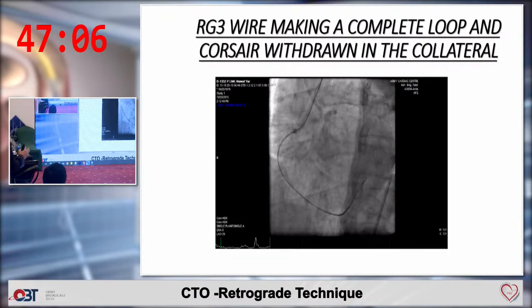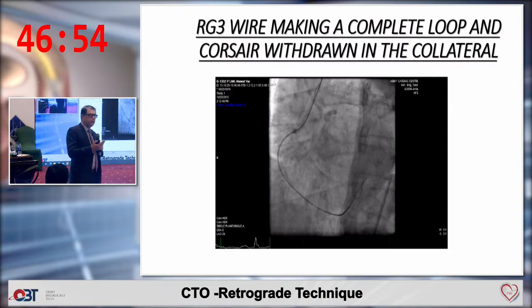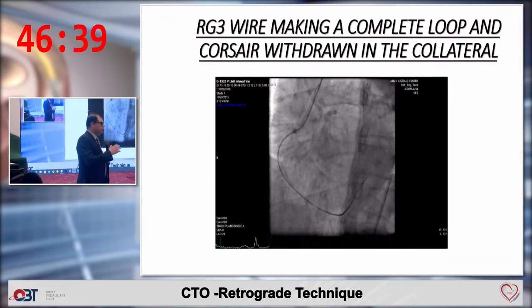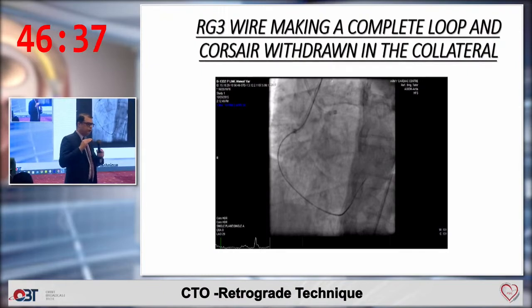Reverse CART, as he has mentioned, is the usual approach that we take once we are doing a retrograde PCI. But in this case, our wire was luminal throughout, from the retrograde Corsair to the proximal cap. Once your wire is luminal, there is no point in doing reverse CART. You do reverse CART only when your wire is subintimal. So you take your antegrade wire subintimal, then do a ballooning and re-enter from the retrograde wire.